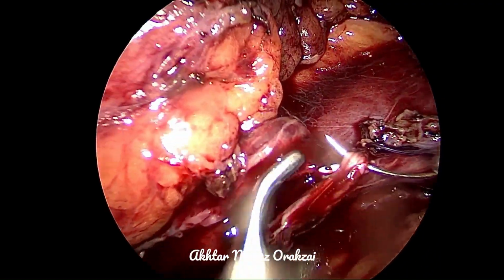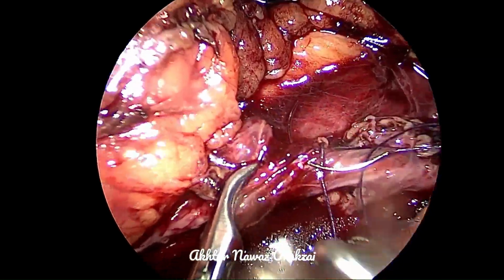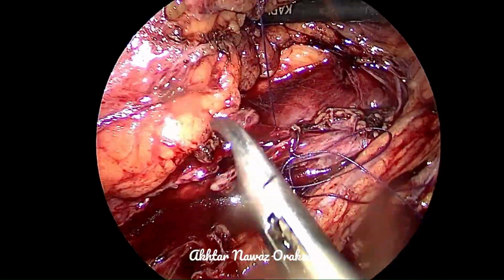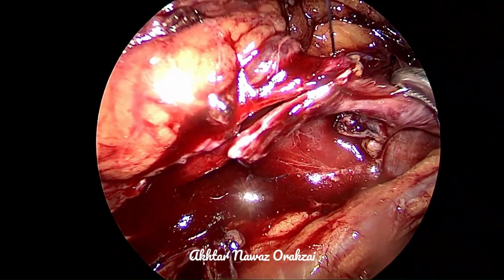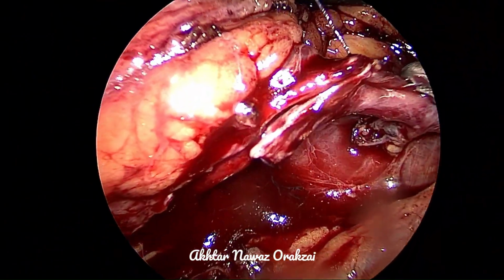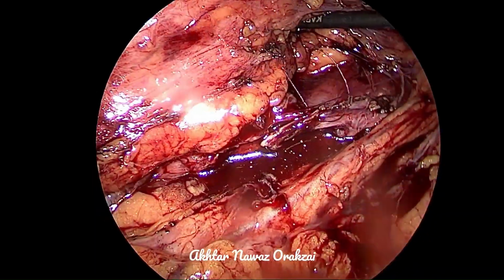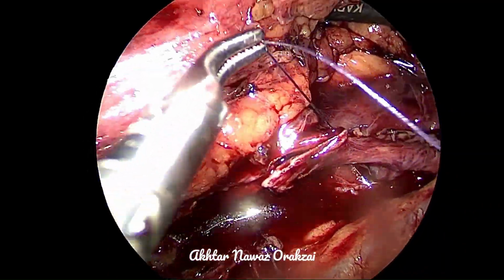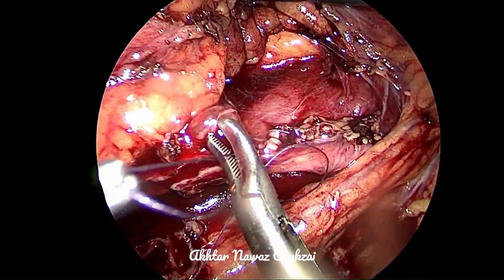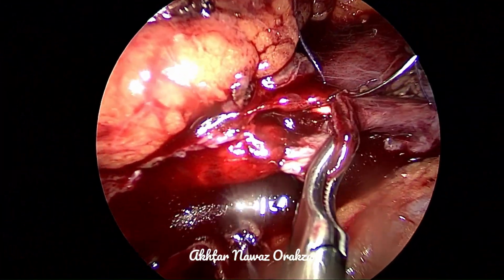Now the rest of the anastomosis continues. So the initial 2-3 stitches need to be extremely fine. So after water tightness, another principle is a free drainage, and for that free drainage we have placed a DJ stent.